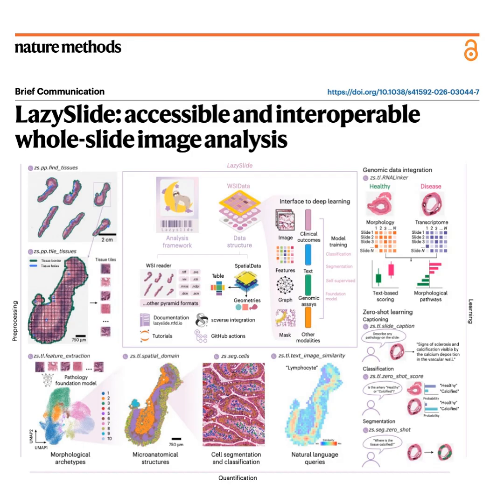It accelerates the workflow exponentially. Okay, recap time. Zero-shot learning allows AI to analyze tissue without specific prior training. It uses cosine similarity to match text prompts to image features. Right, finding the narrowest angle between the text arrow and the image arrow. Exactly. And the system can perfectly identify organs or segment-specific cells just by being asked in natural language.